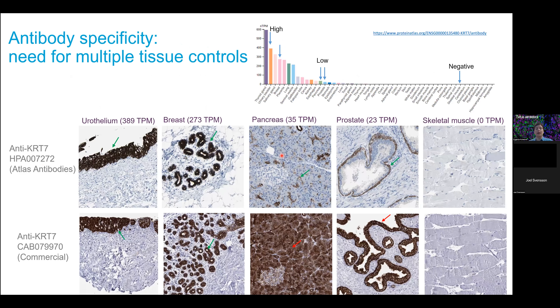In the upper panel, you can see the immunochemical staining with our keratin-7 antibody, HPA7272, where we do see expected cytoplasmic expression — strong expression — in urothelial epithelial cells and in breast glandular cells. Importantly, in these low-expressing tissues such as pancreas and prostate, we see a specific staining pattern in the intercalated ducts of the pancreas and in the basal cell layer of the prostate, while skeletal muscle, which is supposed to be negative based on the mRNA expression, is negative, as expected.